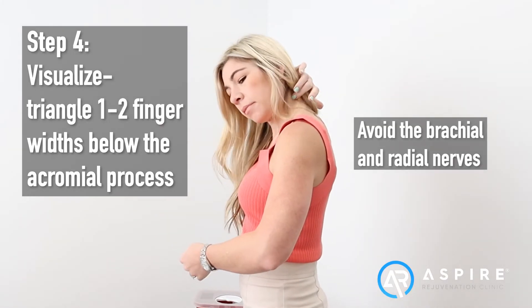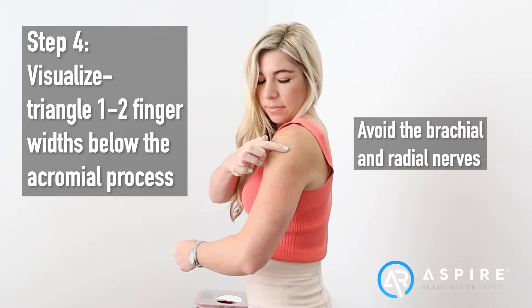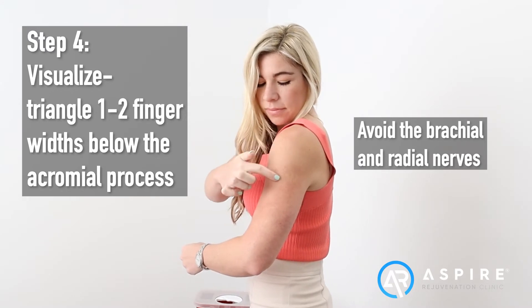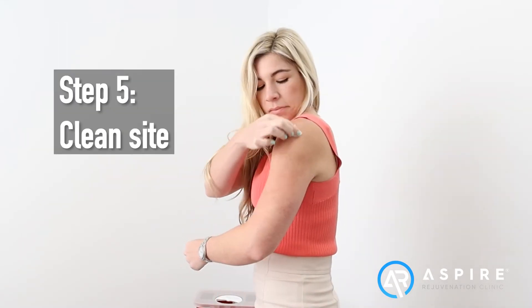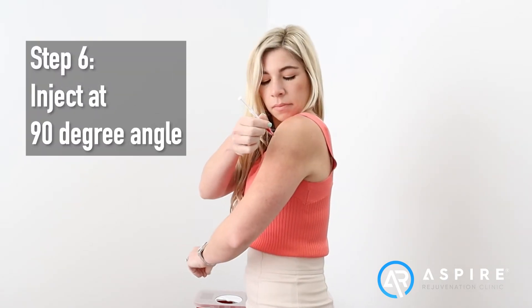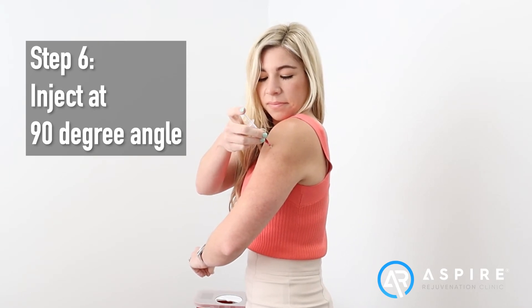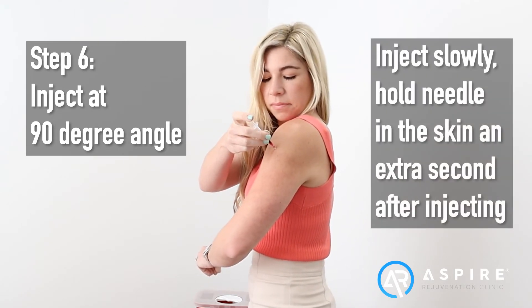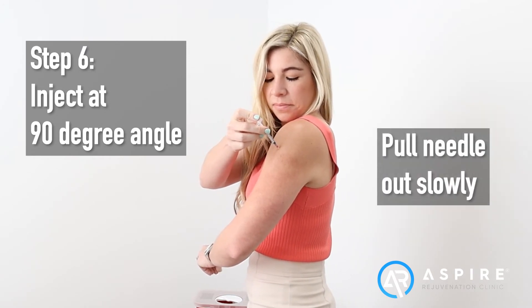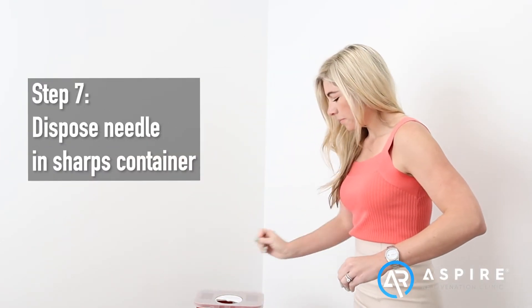Before injecting, triangle one to two finger widths below the acromial process with the distal point mid axilla. Avoid the brachial and radial nerves. Then clean the site. Inject at a 90 degree angle. Inject a maximum of one milliliter. Dispose of the needle properly in a sharps container.